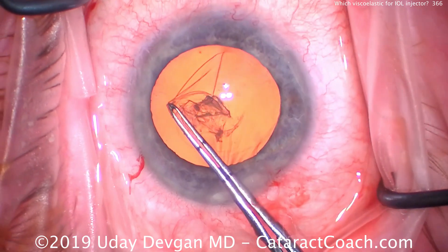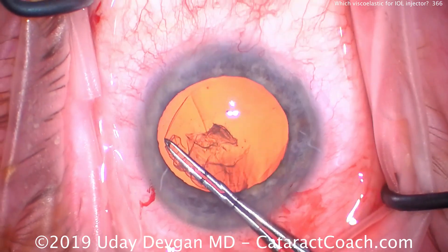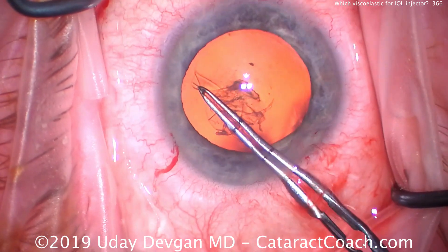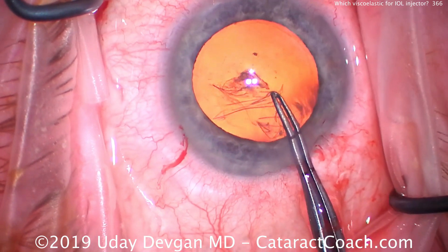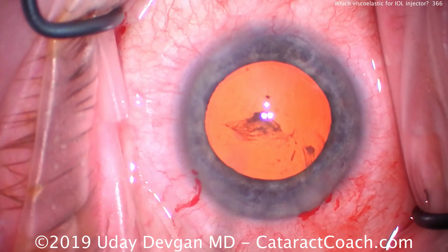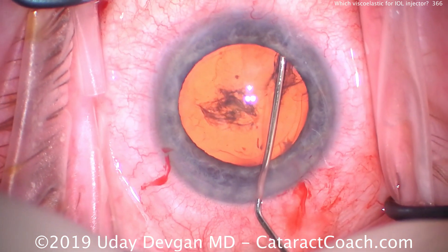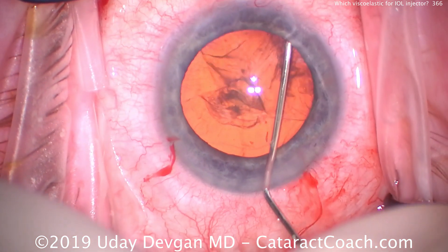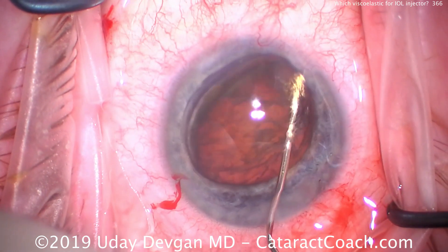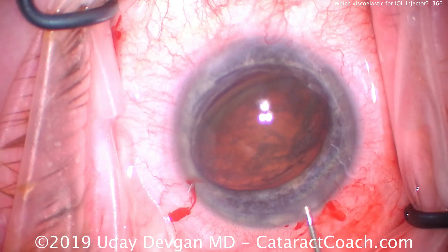Most manufacturers use the word 'coat' in the name of the viscoelastic agent to help you remember. A cohesive agent is thicker — think of it as jelly or jam, more solid than liquid. It tends to stay together, hence the name cohesive, and it doesn't coat things as well. Dispersive stays in the eye very well.